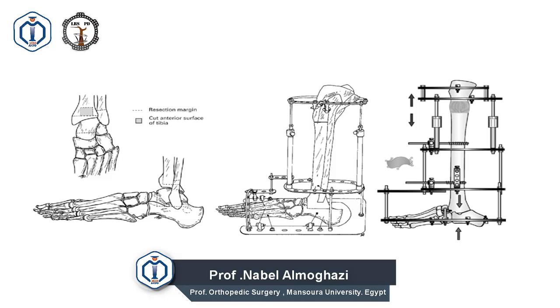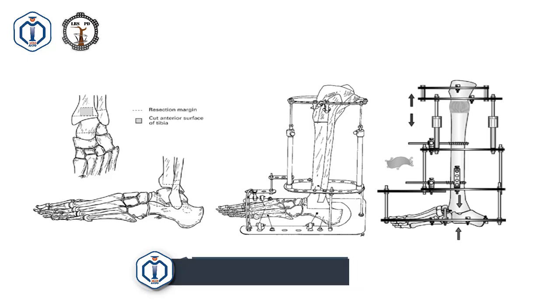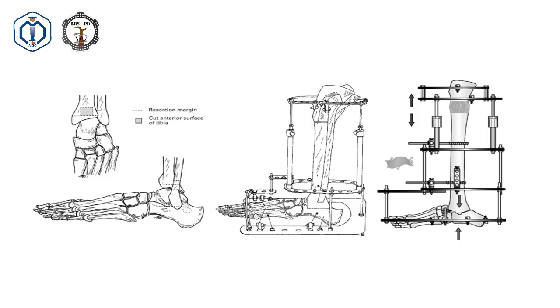And this is the diagram showing the external fixation, so resecting the distal end of the fibula, malleolar approach, and here L-shaped to match the calcaneus and the remnant of the talus, and applying the fixator, and here for lengthening to compensate for shortening. Here I use these 3 rings and a foot ring.